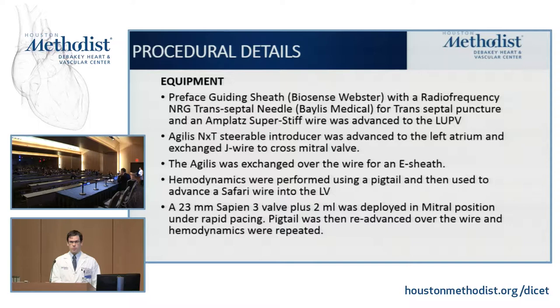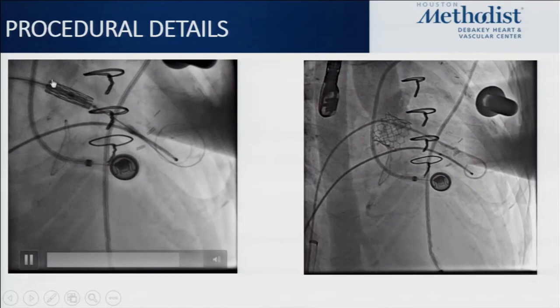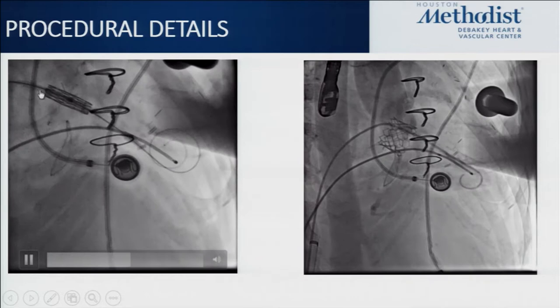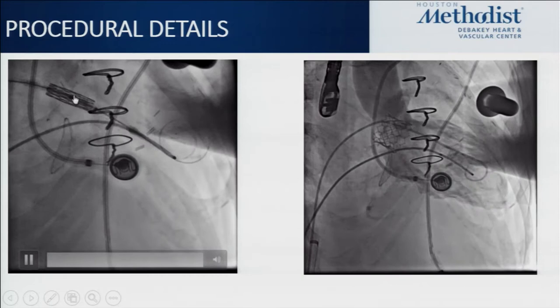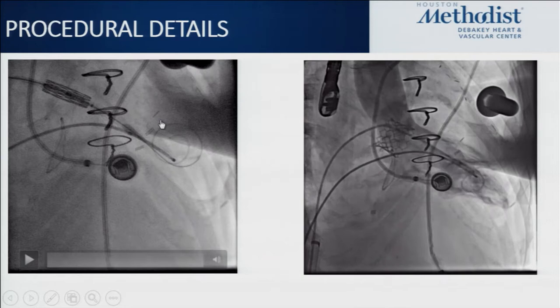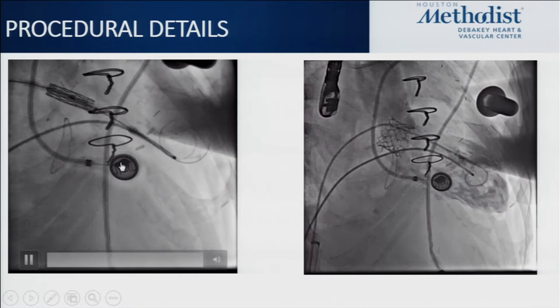Moving to the intervention and fluoroscopy: you can see the valve positioning. Important notes — going too atrial risks insufficient purchase to anchor the valve, potentially resulting in left atrial ejection. Going too ventricular can obliterate the LVOT. In this case, the valve was deployed under rapid ventricular pacing to stabilize positioning. Post-procedural images show no residual MR and hemodynamics confirmed a good gradient afterwards.